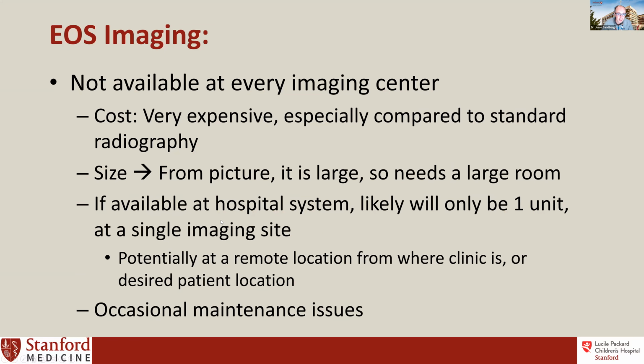Now, it's not available at every imaging center. It can be quite costly to start the program compared to standard radiography. From the picture, it is quite large, and so it needs a large room. And in general, if it is available at a hospital system, they'll only have one unit at a single imaging site. So it's potentially at a remote location from where the clinic is or from where your desired location is. And there are occasional maintenance issues that sometimes arise with these.